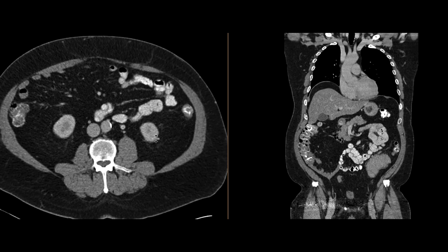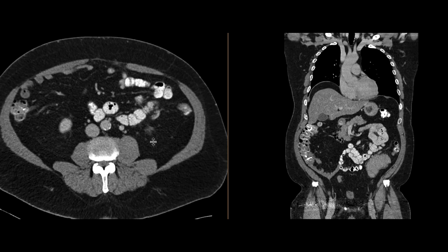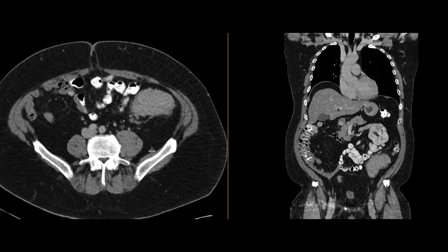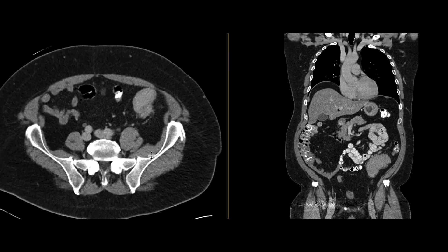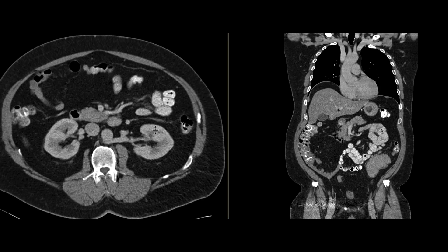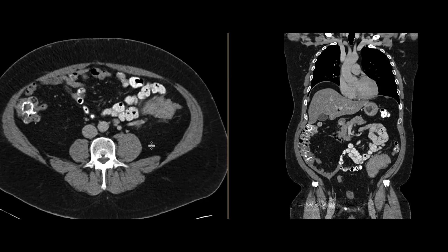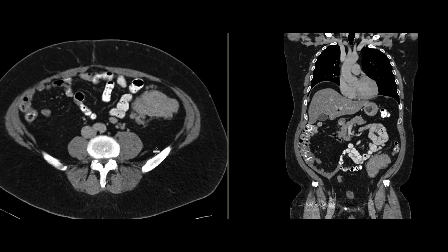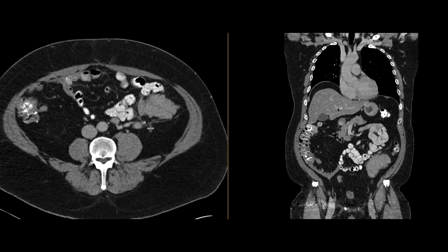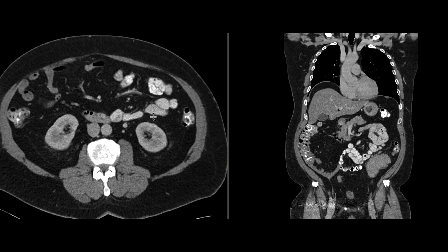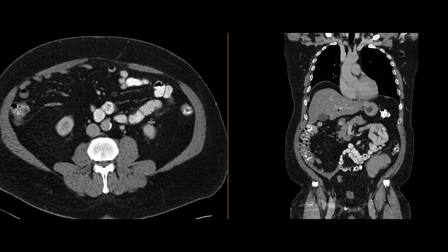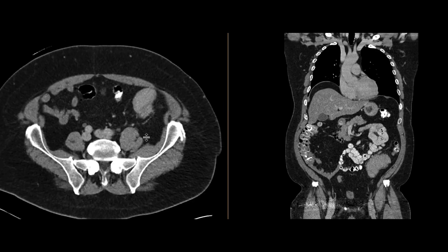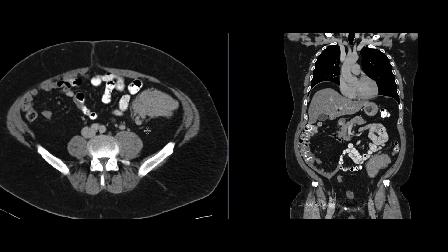This turned out to be lymphoma, and this is a great look for lymphoma. You have a fairly large mass with bowel passing through it, it's not causing any bowel distension or bowel obstruction, and you have this adenopathy — all of which are great features consistent with this diagnosis of lymphoma.